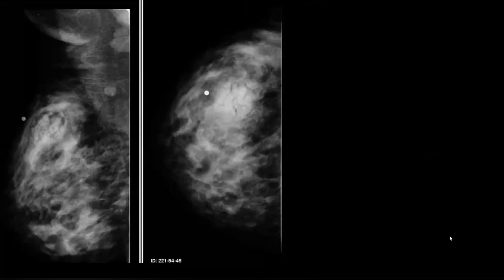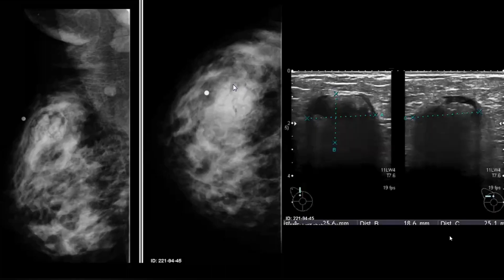The first breast case: the patient had a palpable lump and was lactating. These are mammographic images — MLO and CC views of the right breast — showing a mixed-density lesion. On ultrasound, the lesion was mixed echogenicity with posterior shadowing. This is a case of galactocele. You should know by heart the differentials for a mixed-density lesion, and then, looking at the history, label them accordingly according to priority.